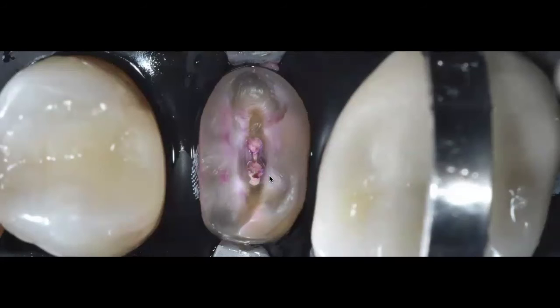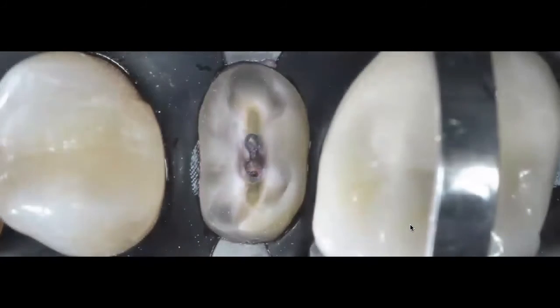The patient had some composite here and there left from the previous core. I remove any remnants of that old composite. And once I applied the caries detection, maybe 2 to 3 times, it was very easy and quick for me to get what you're seeing right here, a beautifully nice peripheral seal zone.